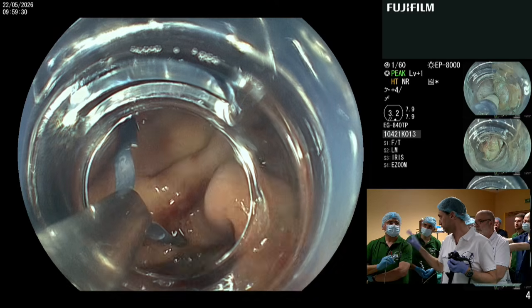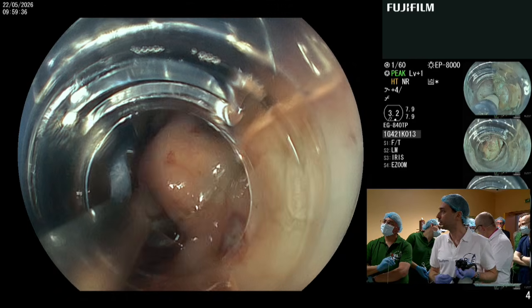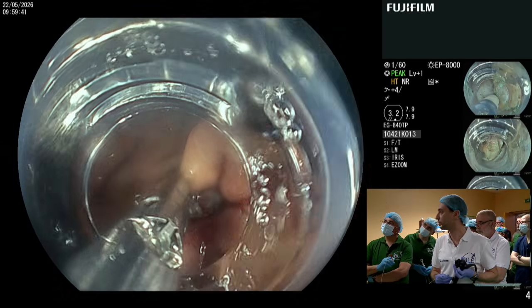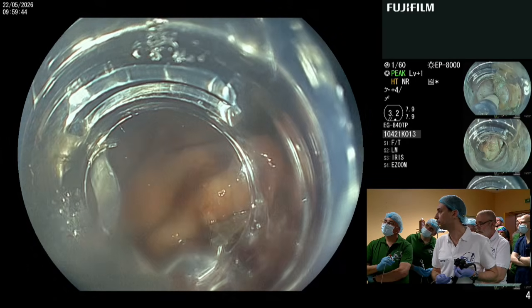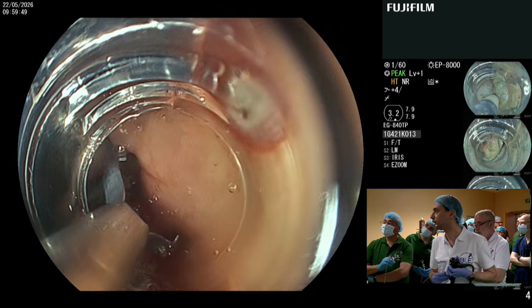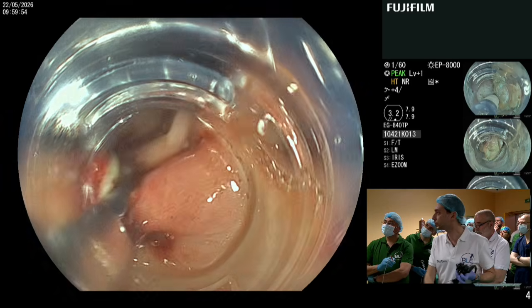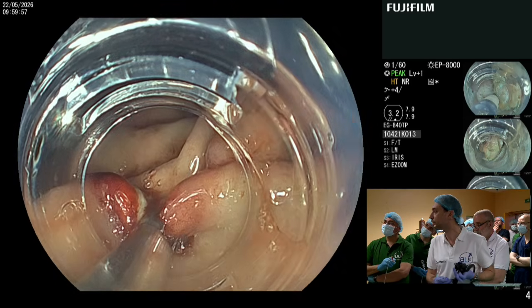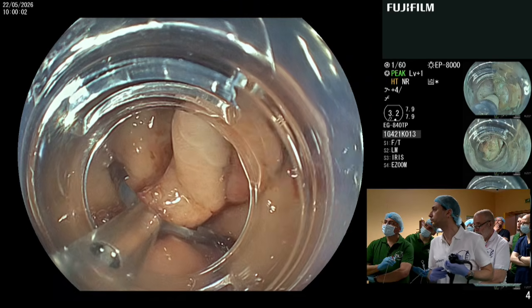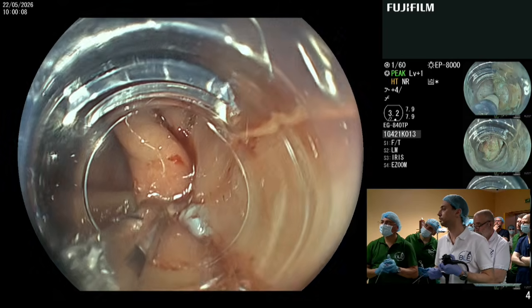So don't deploy it, because we have to do the following technique. You will grasp here, close, don't deploy. No, I will do it differently. Open, sorry, open. I will go to the other edge here, the proximal edge here, okay. Close, all right, close. Now, I will push, open again, nice. Now, close, deploy, fire.